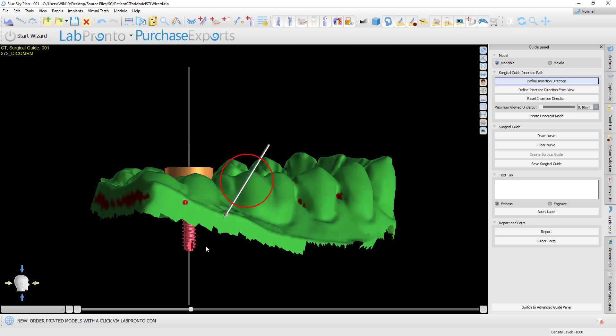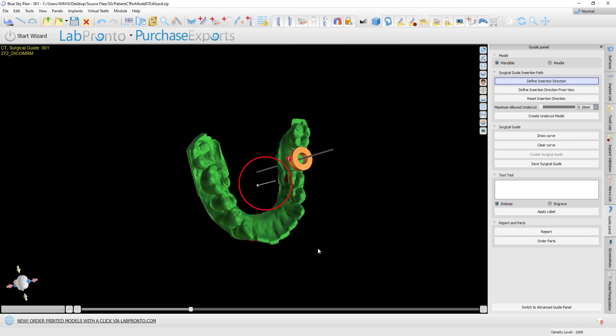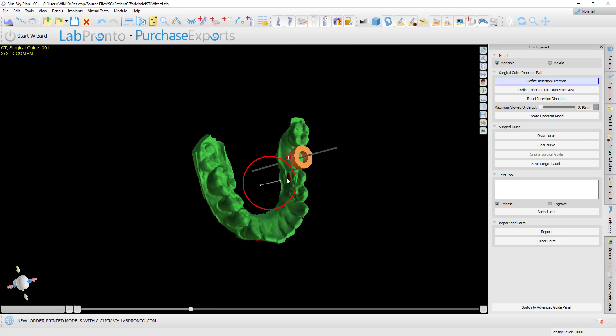If we wanted the software to act the same way it did in previous versions, we could click the button 'define insertion direction from view.' We can see the brown areas where the undercuts would be removed.